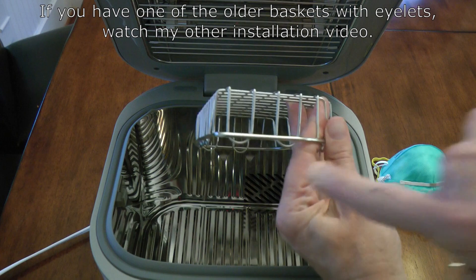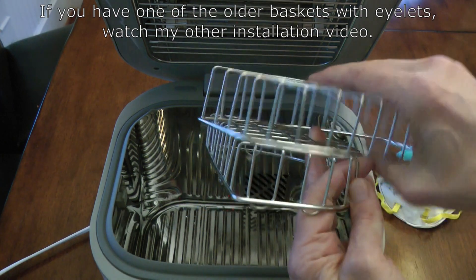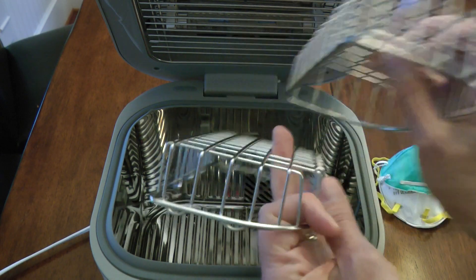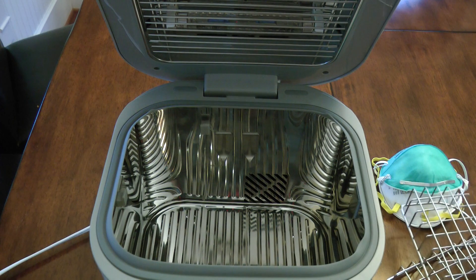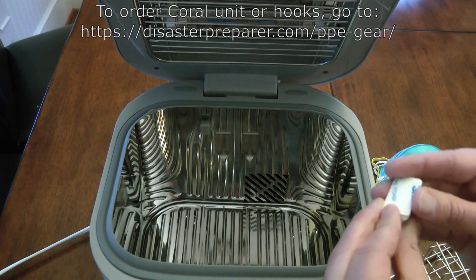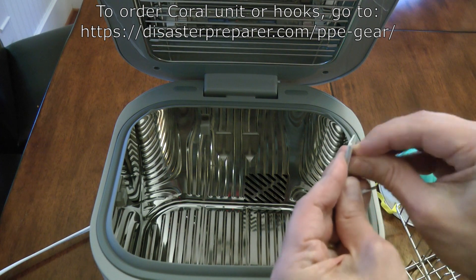Unfortunately, the new models have a slightly different basket. The old basket had little eyelets here that were used for mounting. The new baskets, while they're the same size, don't have the eyelets anymore — they're just slightly different in design. This ends up changing where the little metal hooks need to go inside to support the basket to make it a shelf. The metal hooks I sell from my website, disasterrepair.com, are nice stainless steel hooks.